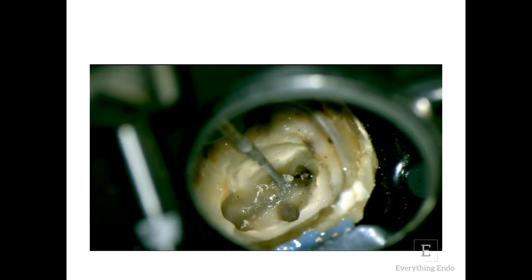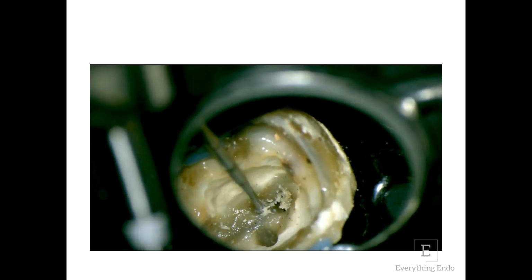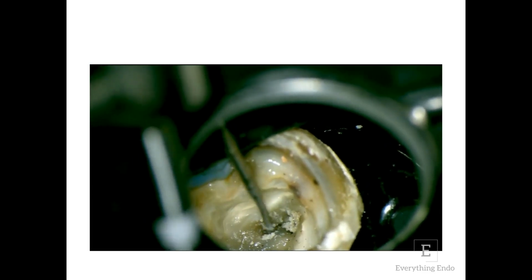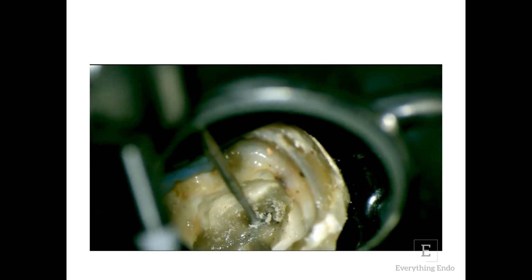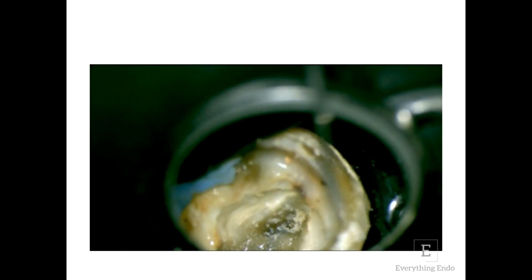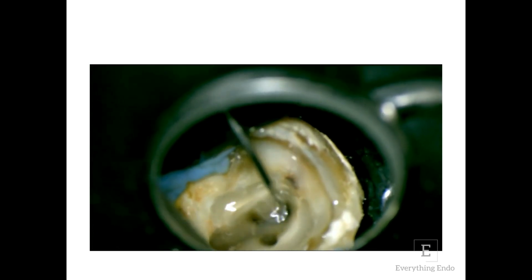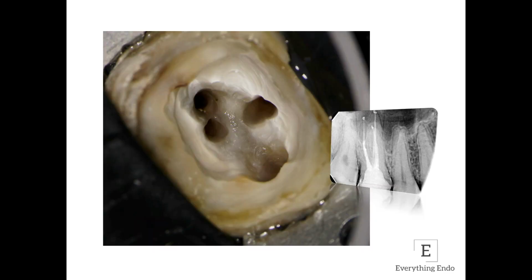So what I'm doing here is drilling out the dentine on the floor with a Munz burr. We'll discuss what a Munz burr is a little further down in the lecture. So I'm digging down into the floor of the pulp chamber to locate the MB2 canal. I would then flush out these debris with saline. And if you can see, that's exactly where the MB2 is present, right down. And that's exactly where you can locate it. And this is the finished post-operative result.